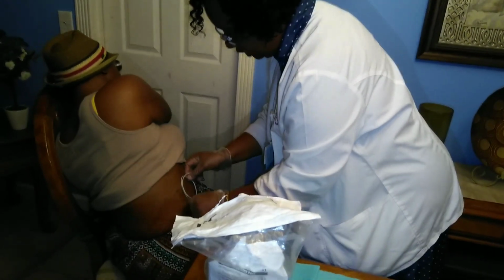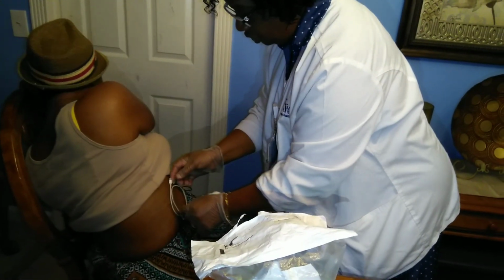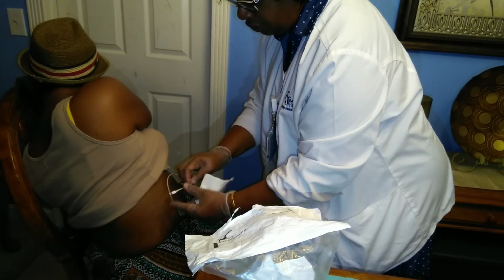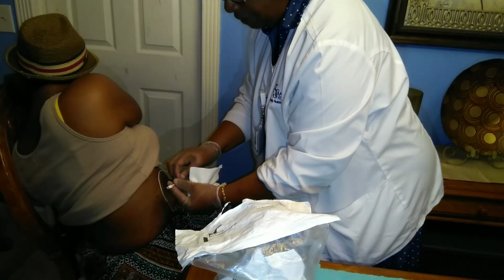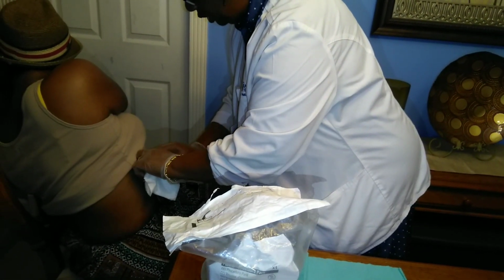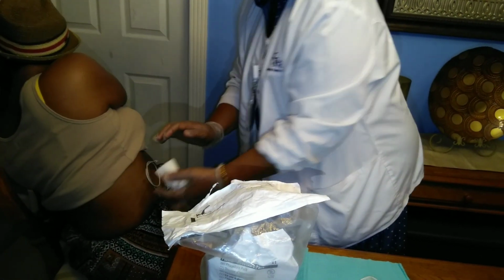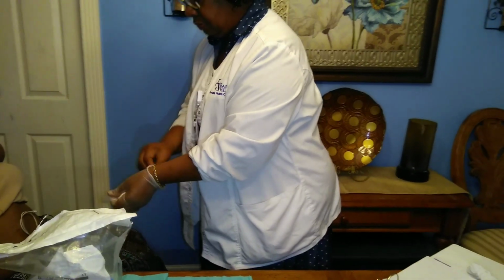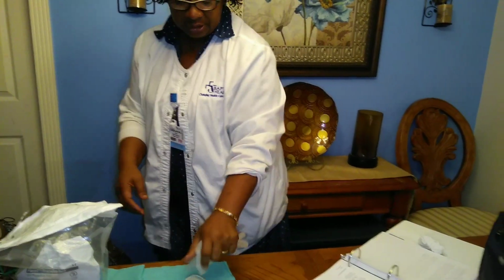And what you will see is a catheter in the patient, like this, okay? And usually the tip of the catheter is sterile. It has a cap encapsulated around this catheter, okay? So I usually just put it here on the patient. I put all this in the trash. I usually take this and put it in my gloves and put this in the trash. So this gets thrown away.